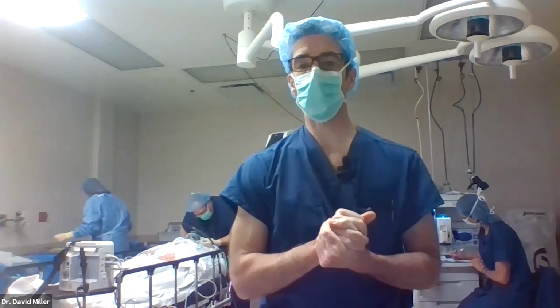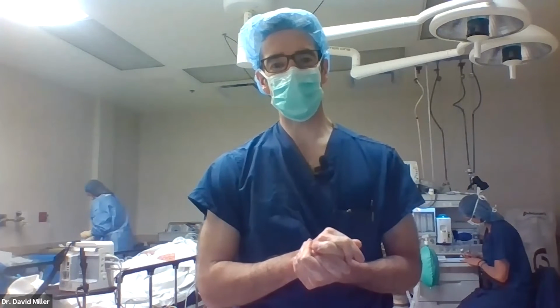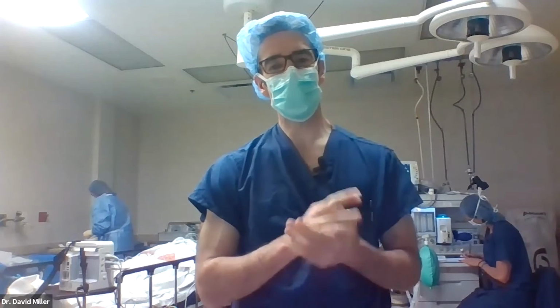The role of silicone oil in surgery. What is the role of silicone oil in surgery? Silicone oil is nice to use for long-term tamponade, especially in patients who cannot position face down, and for repeat surgeries where there's indications of proliferative vitreoretinopathy. So I try to stay away from oil. I tend to use it for reoperative cases, or patients with breaks inferior that I know they cannot position well and the gas won't be at the bottom of the eye long enough.